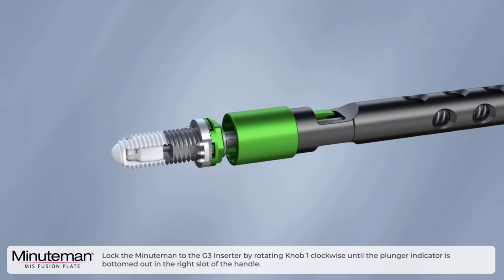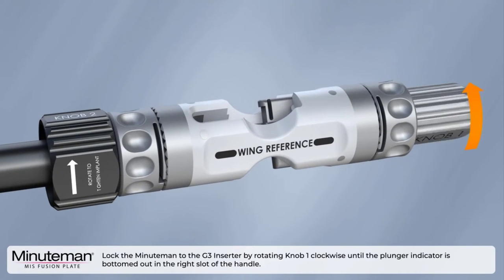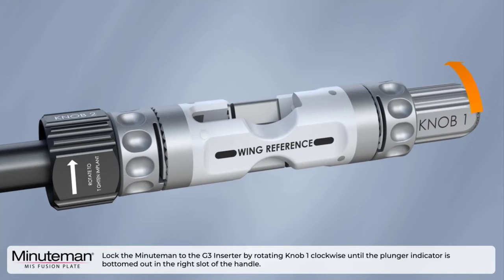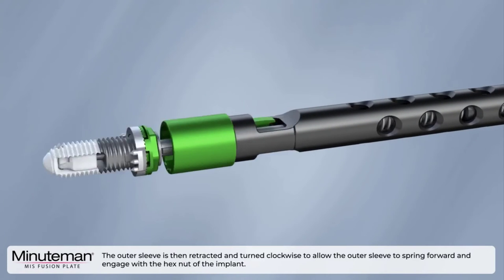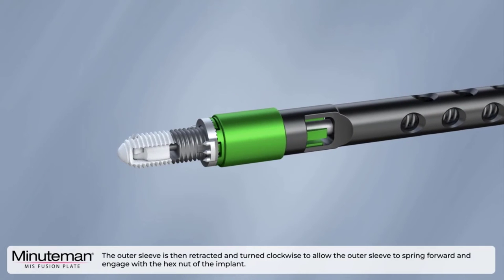Lock the Minuteman to the G3 inserter by rotating knob one clockwise until the plunger indicator is bottomed out in the right slot of the handle. The outer sleeve is then retracted and turned clockwise to allow the outer sleeve to spring forward and engage with the hex nut of the implant.